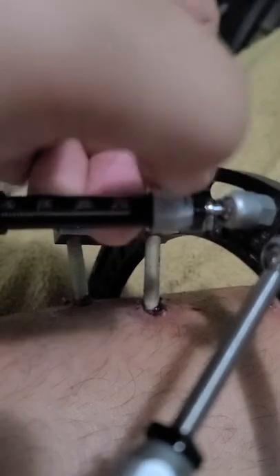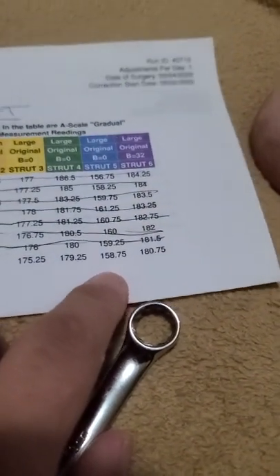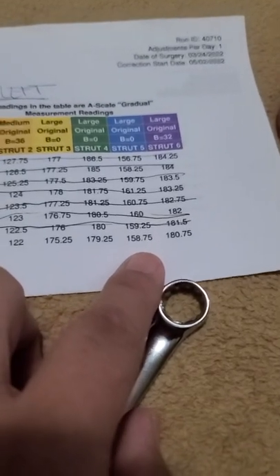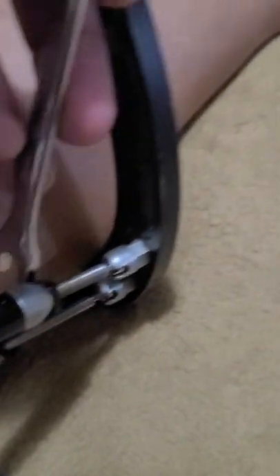Number two is too far to reach right now, so let's do number five instead. Yesterday we finished number five at 159.25 and now we have to go down to 158.75. Just loosening the struts now.